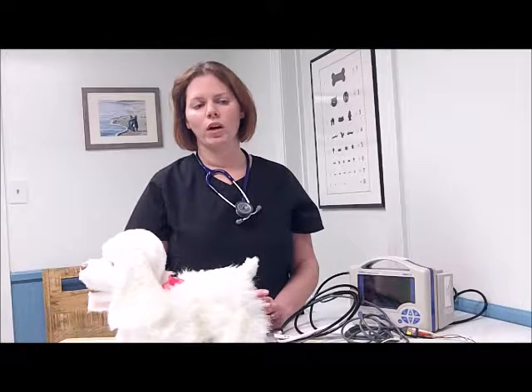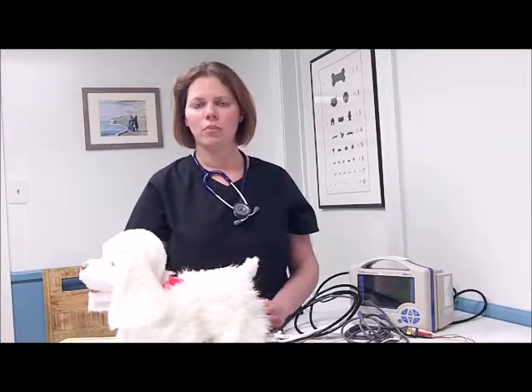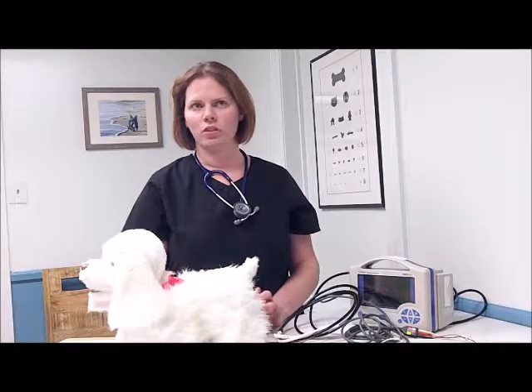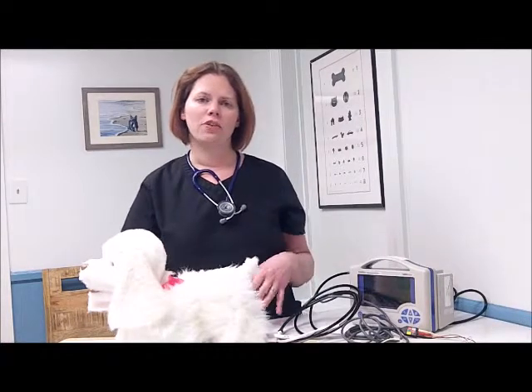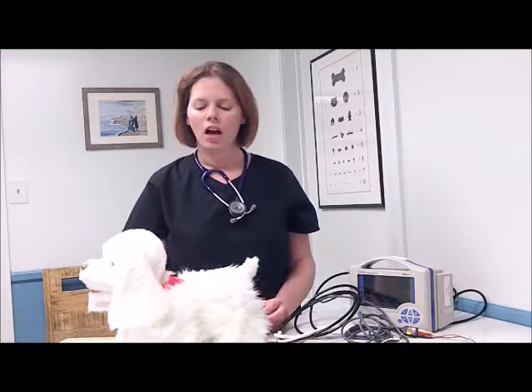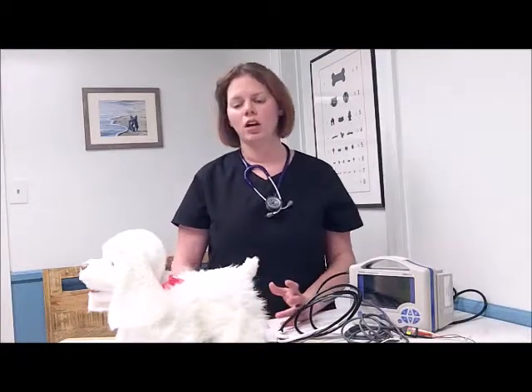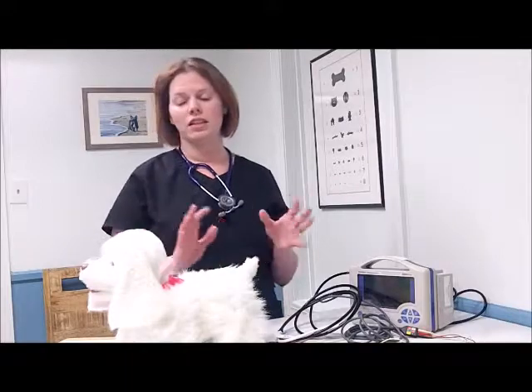And if we are at a point where our blood pressure is too low and our anesthetic level seems appropriate, then we may need to increase our fluid rate to compensate. Anything lower than 60 millimeters of mercury, I believe, is where our tissues start to suffer and the perfusion is too low, and we can cause some tissue damage, particularly in the kidneys. Other parameters that we can use to monitor are more visual aids, such as the actual physiological status of the patient itself.